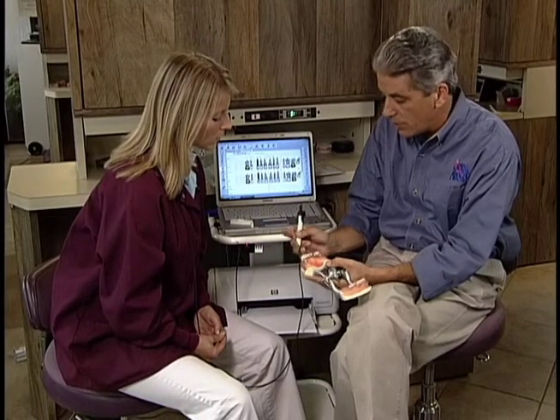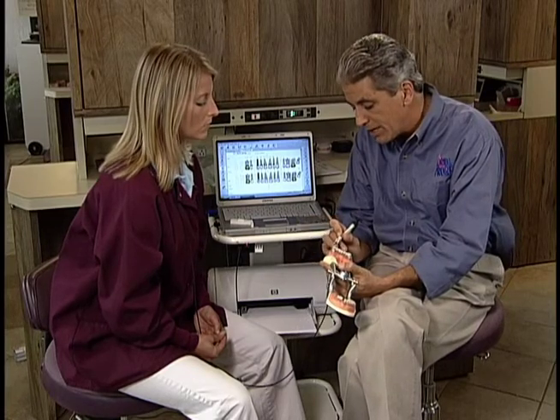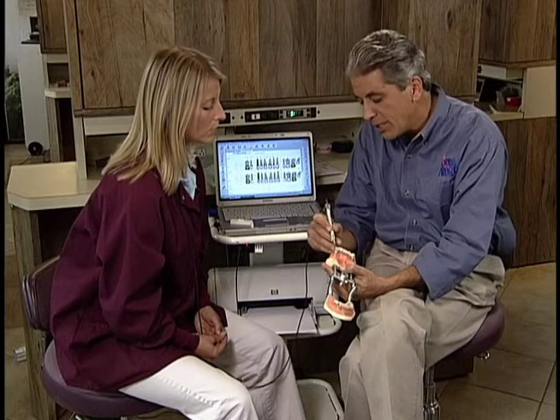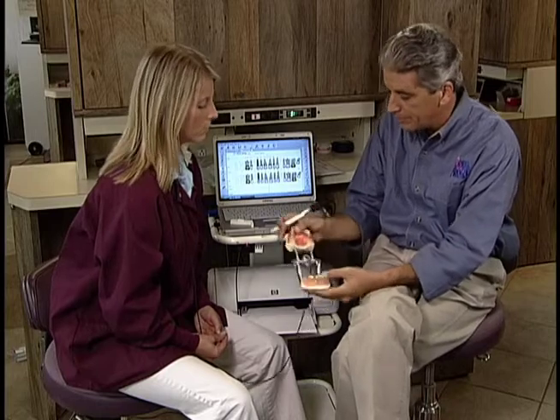Sometimes it's not quite so obvious. Even though I'm here, I'm being stopped by the incisal edge of those anteriors. So I just need to be mindful that I have to be in contact with the margin.